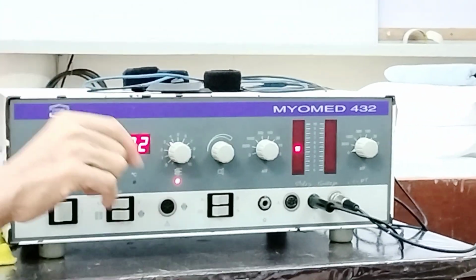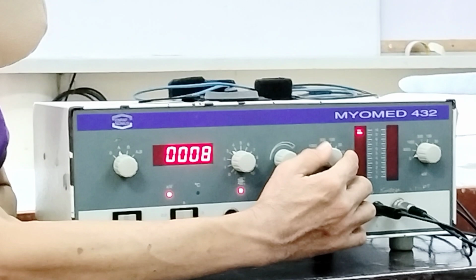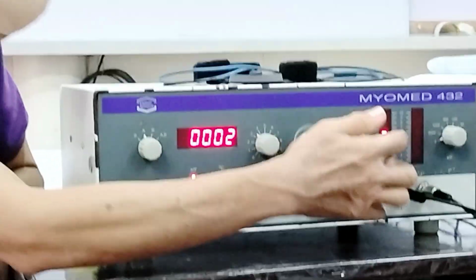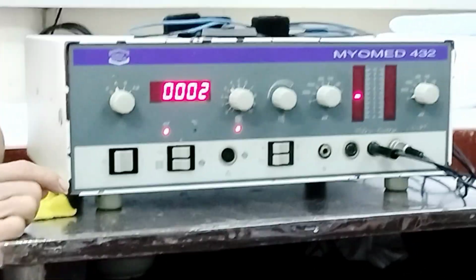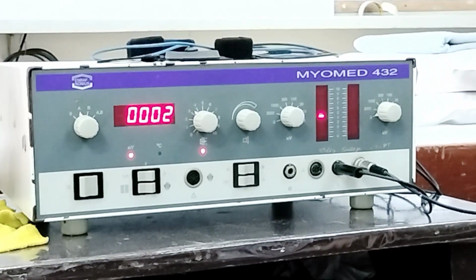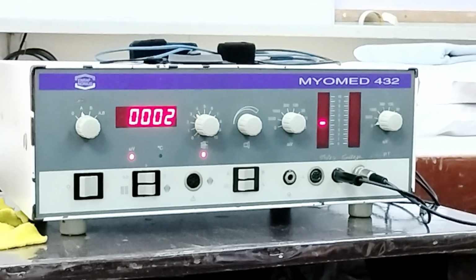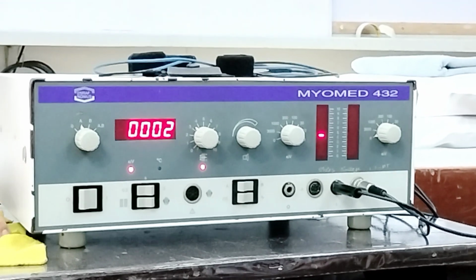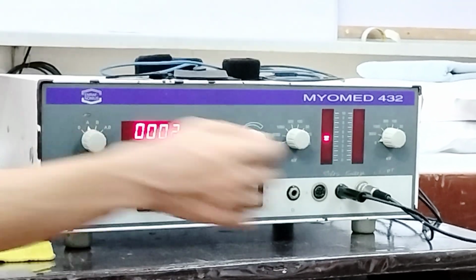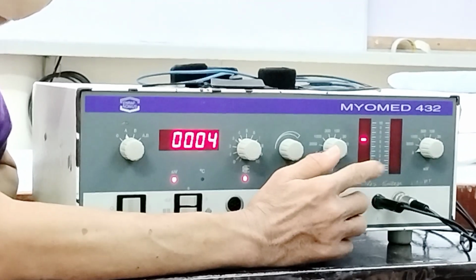If at 10 the bar is not full, you start the training there. But if you place it at 3 microvolts and the bar is not full, you start there at 3 microvolts. So it depends on the signal the machine receives from your patient. It doesn't mean you always start with 3 or 10, it depends on first assessing the patient.